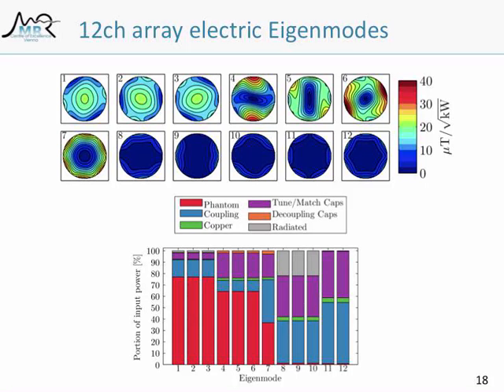efficiency. Exactly. So you can see this way, you have a way to judge how many channels I really have with my array. And it's not only for transmit, you can do that for receive purposes as well, and it works equally well.